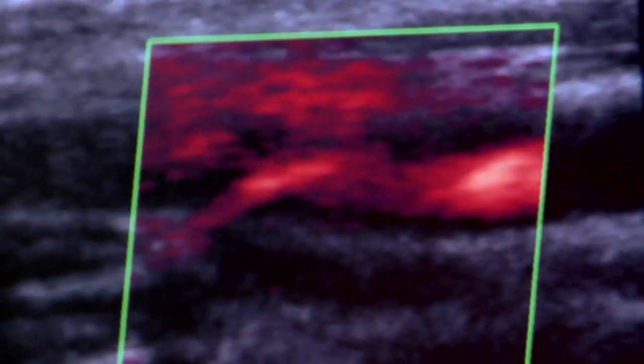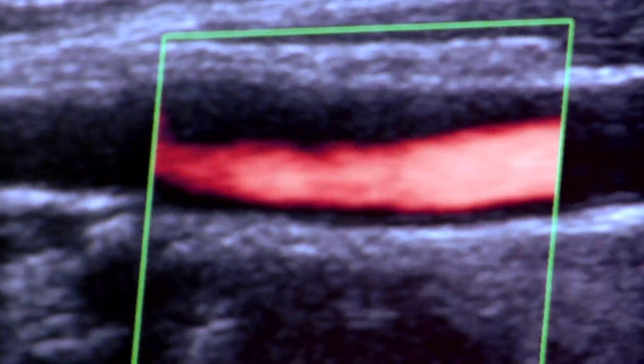The screening of the arteries will document if an artery has any buildup of plaque or cholesterol, which may range from tiny spots of plaque to an occlusive blockage of greater than 80%. The testing will also reveal if the arteries are small, tight, and very winding, which is noted to be tortuosity. Finally, and most importantly, the ultrasound will demonstrate if there is thickening of the artery layers, which is a very strong predictor of heart disease.